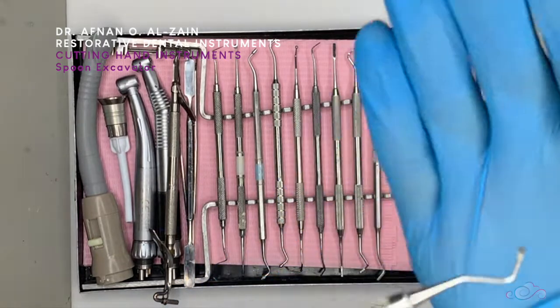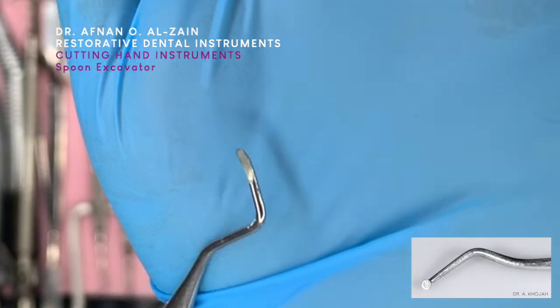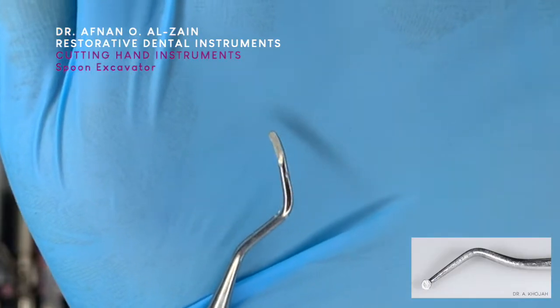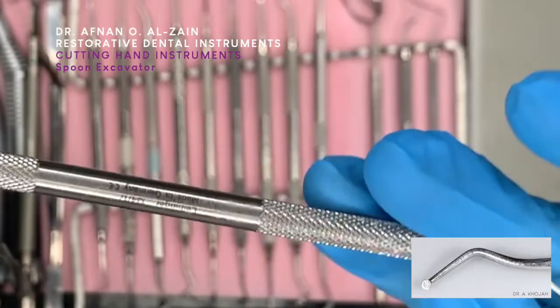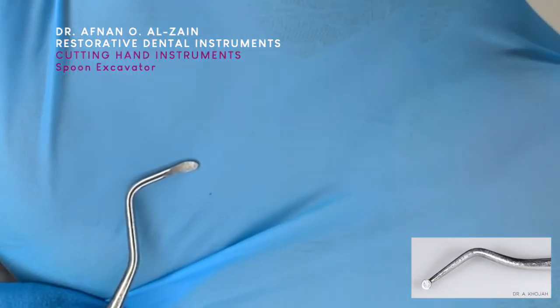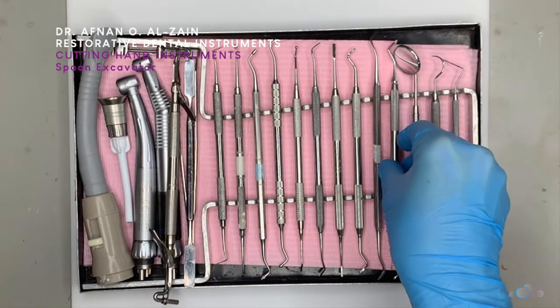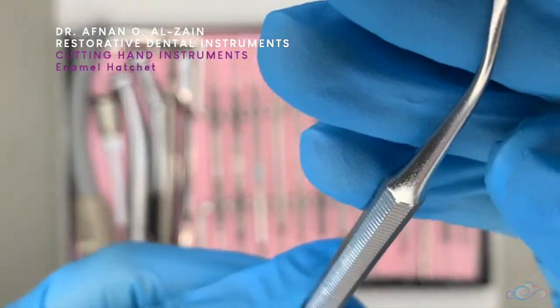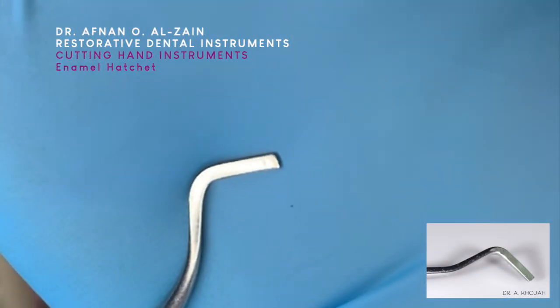This is the spoon excavator. We can see here how it has multiple angles, and it looks like a spoon. It is usually double-ended, and it's used to remove soft caries from the cavity.